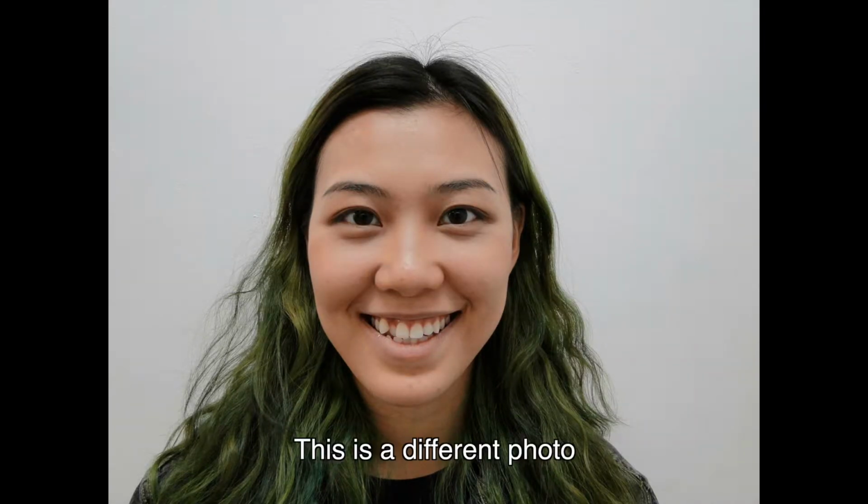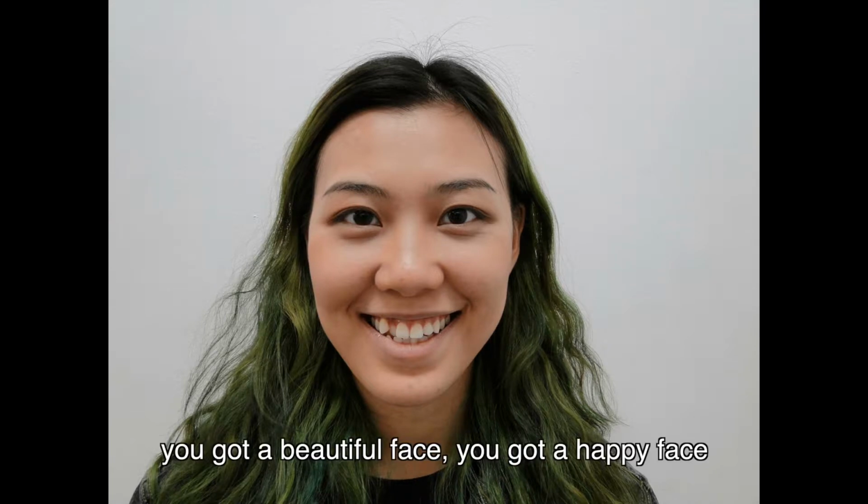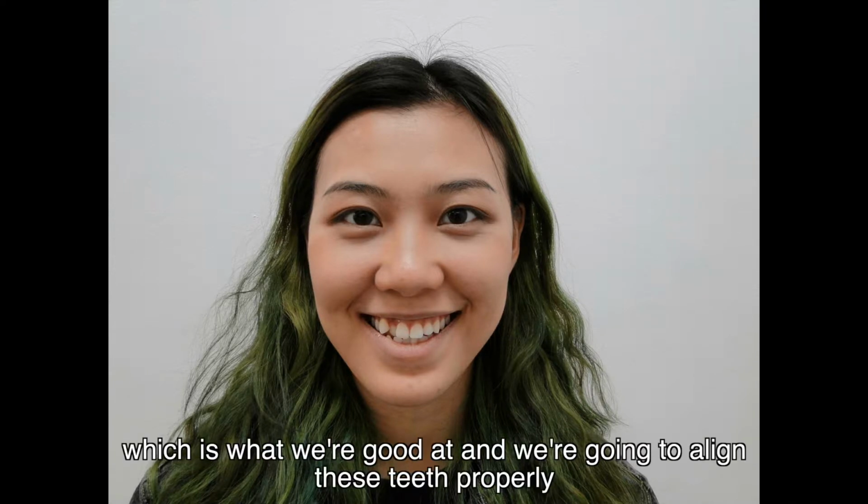Okay, this is a different photo. This one I captured when I asked you to pretend to be very happy. See, look, this is when you really shine, because you can see you've got a beautiful face, a happy face. The only thing that lets you down is the arrangement of teeth, which is what we're good at. We're gonna align these teeth properly.